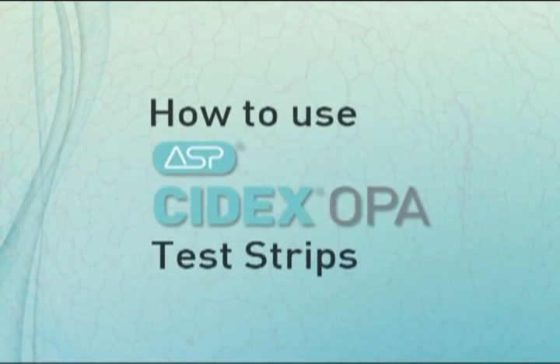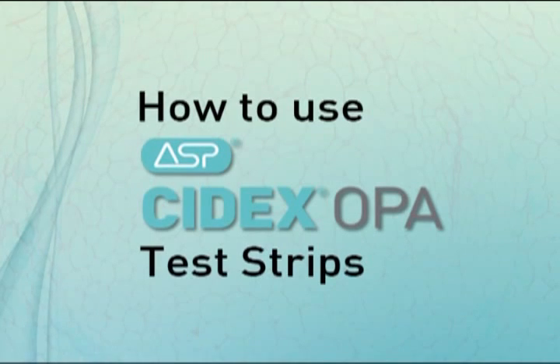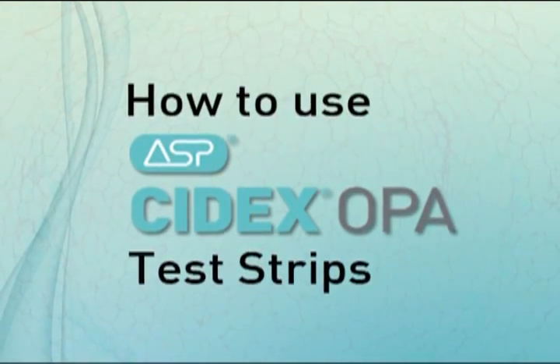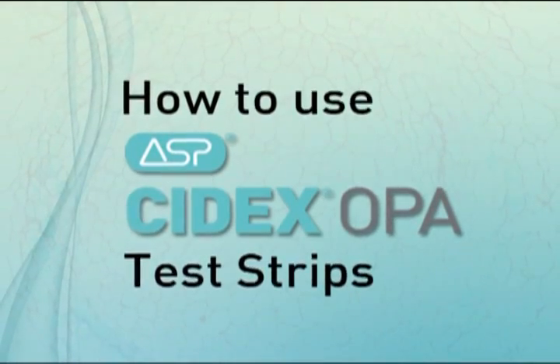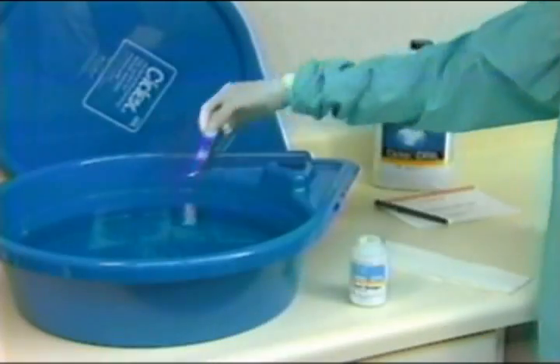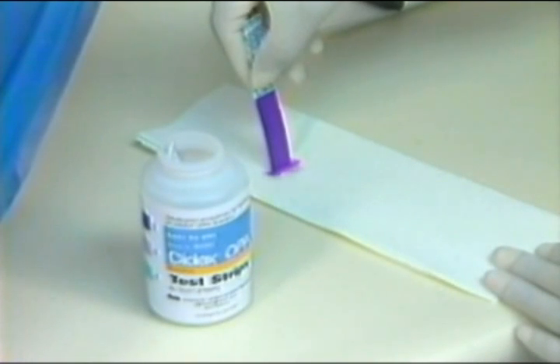As a quality assurance measure, test Cydex OPA solution using the Cydex OPA solution test strips to indicate if the minimum effective concentration is present. Dip the indicating pad of the strip into the solution for one second and remove. Read the results at 90 seconds. The pad will be completely purple to indicate the MEC is present. If any blue appears on the pad apart from the top line, the solution is below the MEC and should be discarded immediately.